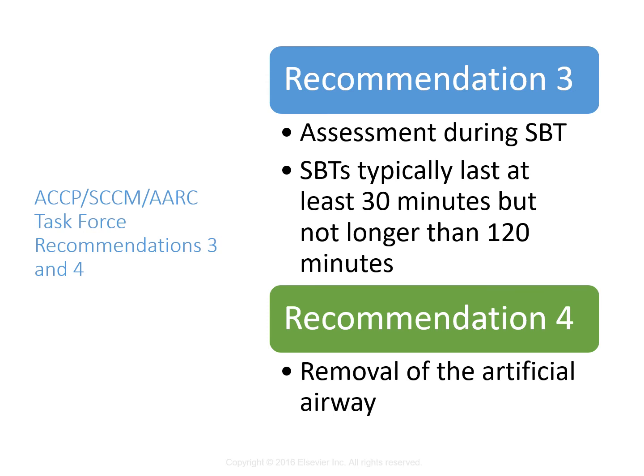But if they fail, the causes of failure and the reasons that require them to be on support should be determined and corrected. So if they fail wean, why did they fail? And then what can we do about it, right? Why did they fail, and what can we do about it? So once we reverse the cause of that failure, and they still meet criteria, then we should do another one in 24 hours. So if you get a future question that says, how often should we attempt weaning as long as the patient's stable to do so? The answer is 24 hours, right? Every 24 hours, as long as the patient's able to do so.